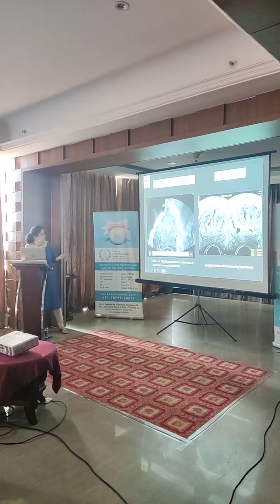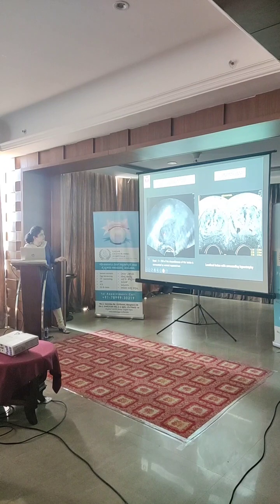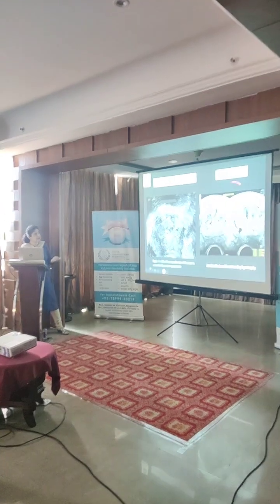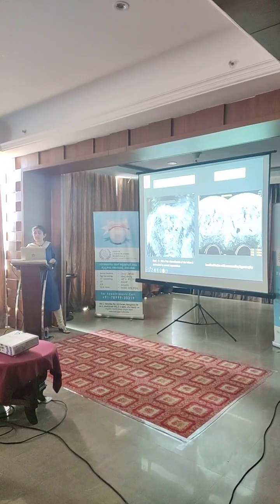But as I move to the left, you will see posteriorly, there is this area which looks typically adenomyotic. Cystic spaces lined by hyperechoic. Look at this shadowing. So this is focal adenomyosis, and this is really rare. In contrast, you look at focal adenomyosis that is surrounded by hypertrophy, and that is called an adenomyoma. And adenomyoma is in fact much more commonly seen than focal adenomyosis.